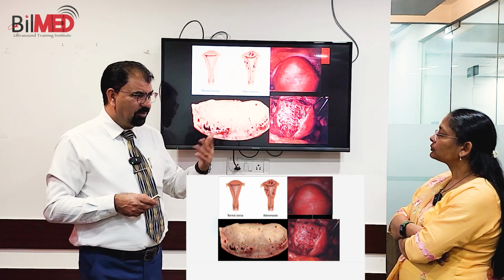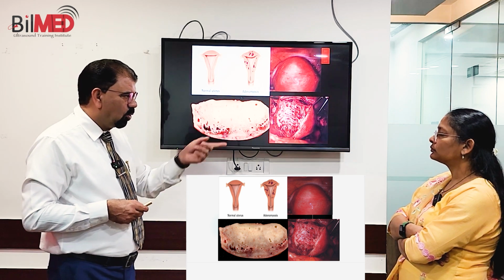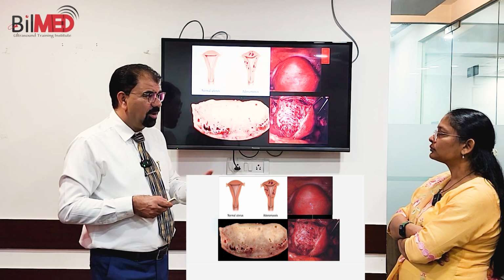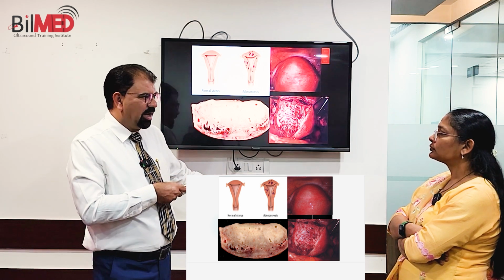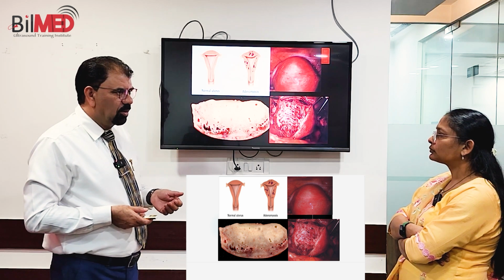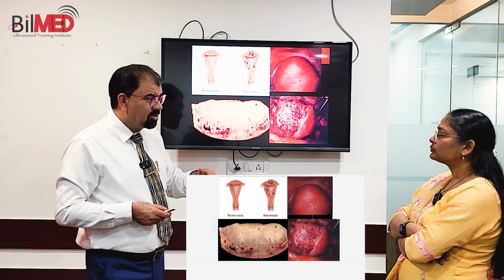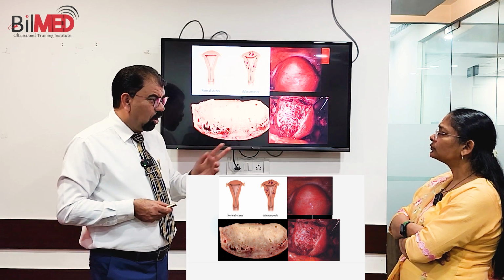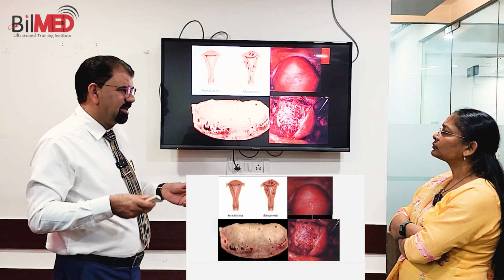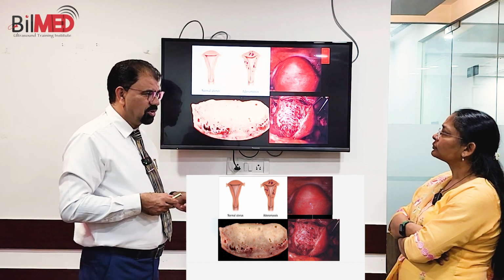So if somebody has diagnosed a 30 millimeter patch with a query fibroid or query adenomyosis, but today you are scanning and not getting it, after some time, maybe 4 days, 5 days, 10 days, today it is not 30, it is 10 or it is 50. So an abrupt change in size, it can increase, it can decrease, is going in favor of adenomyosis.